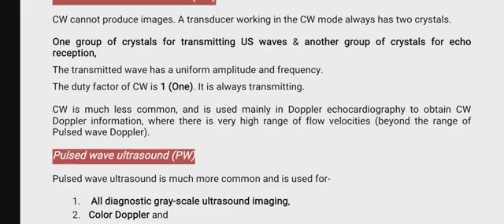So that's why I said earlier in the other class that the transducer speaks and listens. In pulse wave, the same crystal speaks and the same crystal keeps quiet to listen. But it's not so with continuous wave. Continuous wave has dedicated crystals for each function.